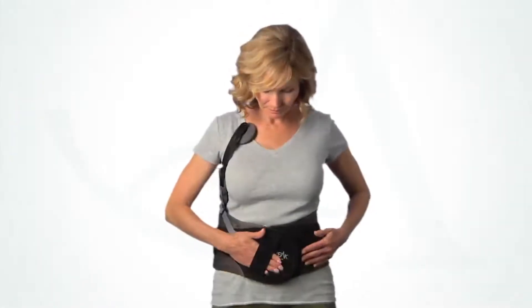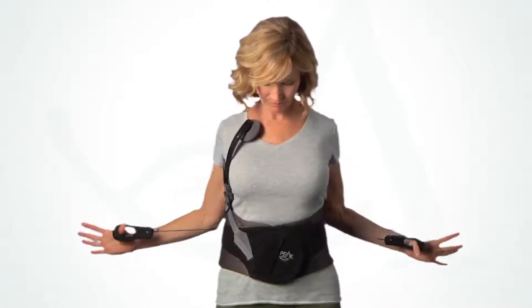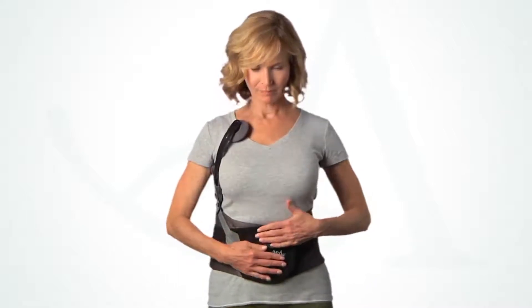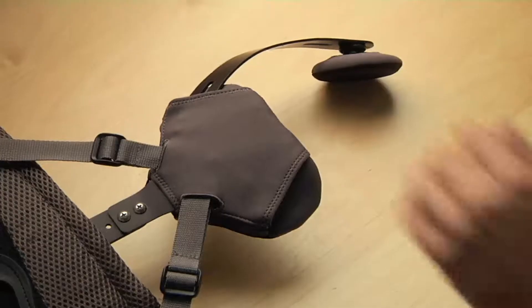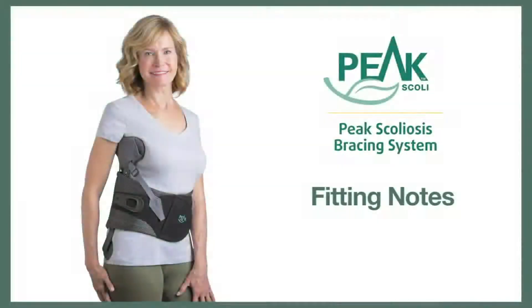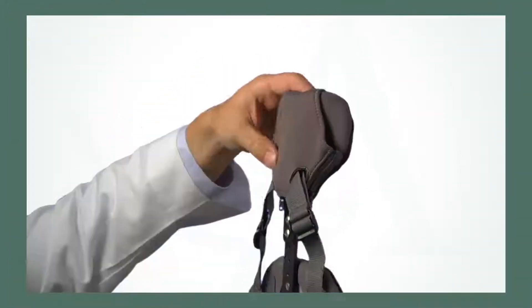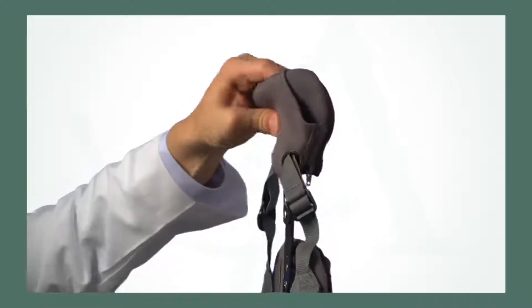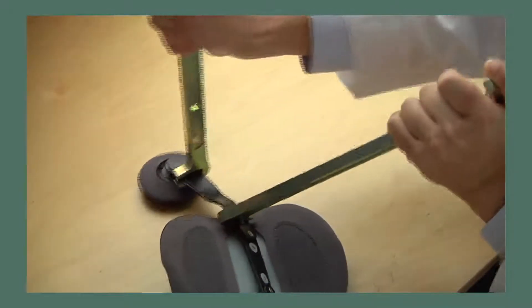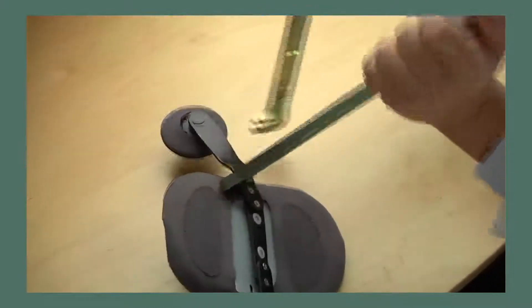Have the patient reapply the brace. The chest pad should land approximately one inch below the clavicle. If needed, the strut can be easily bent to achieve a perfect fit. The thoracic, trochanter, and chest pads have been designed to automatically adjust to the patient. For certain patients, twisting a strut may be required to achieve a perfect fit.